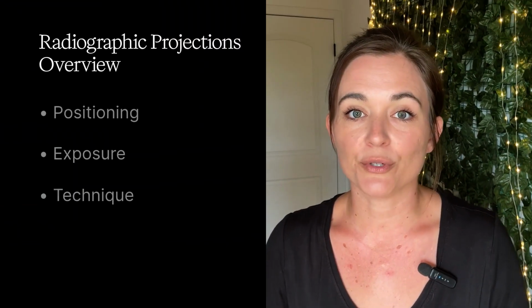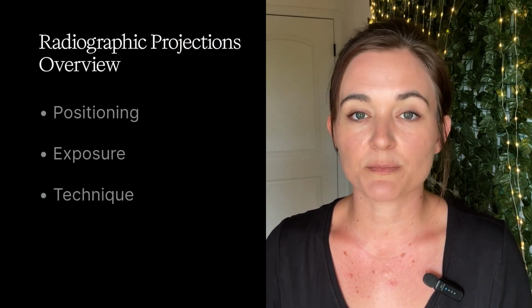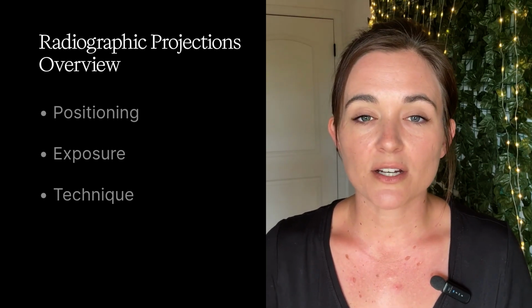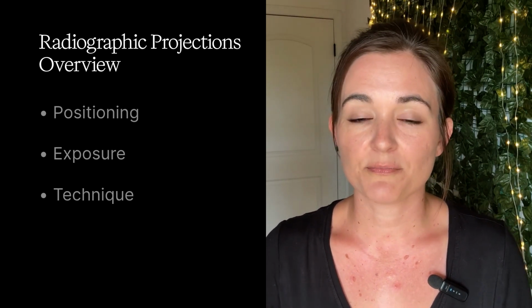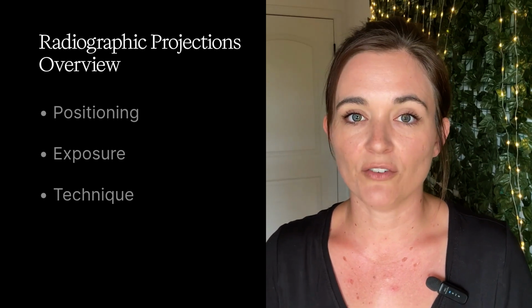We're going to walk through each projection step by step. That means positioning, exposure technique, anatomy labeling, image quality criteria, and common mistakes. For each view, you'll get 2 slides, one for setup and one for evaluation.